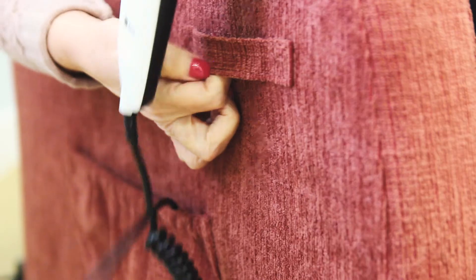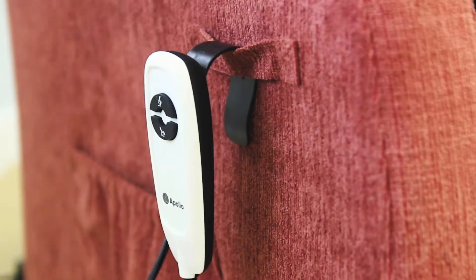The simple big button handset is designed to respond to even the lightest touch. When comfortable, rest the handset on the easy-to-reach loop beneath the armrest.